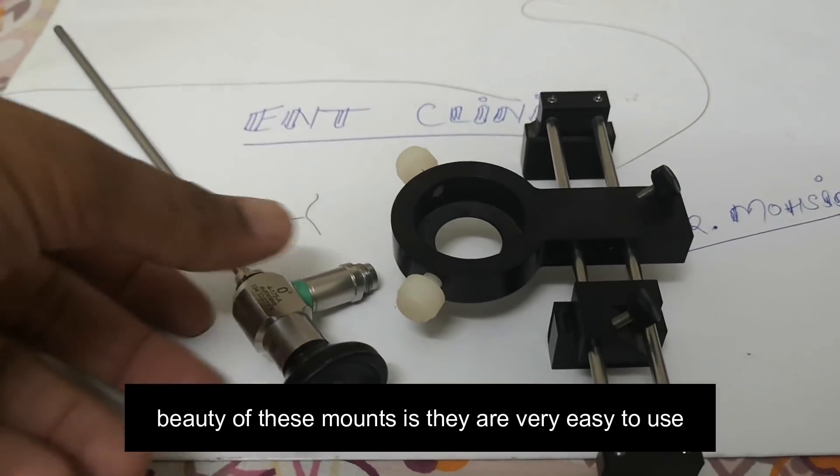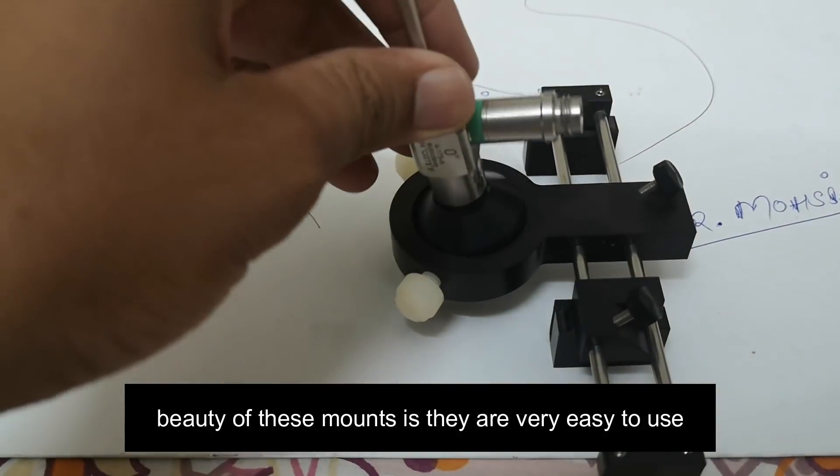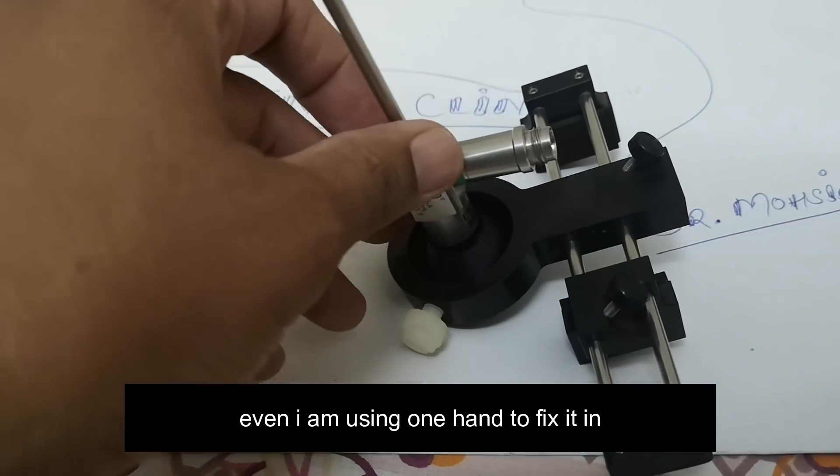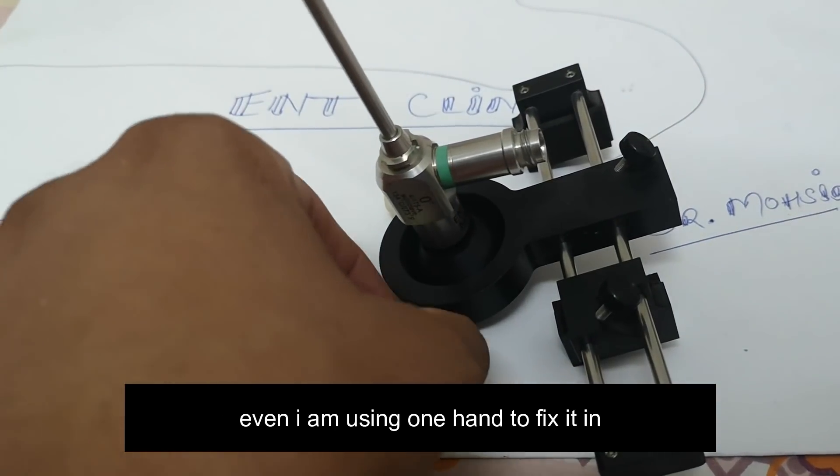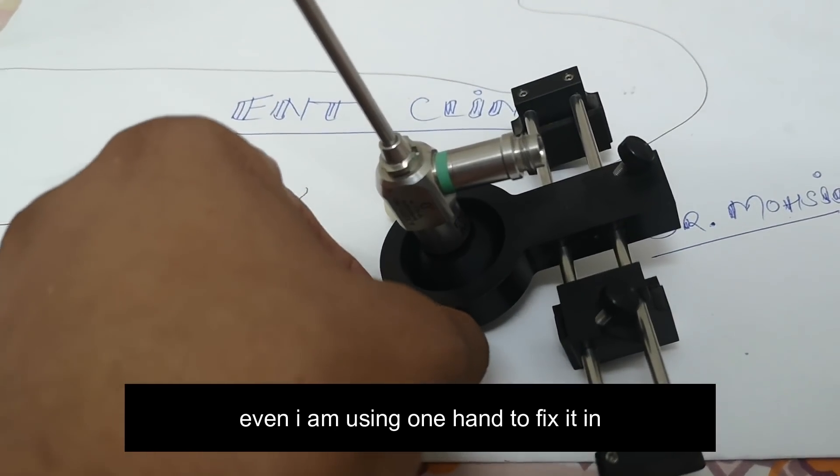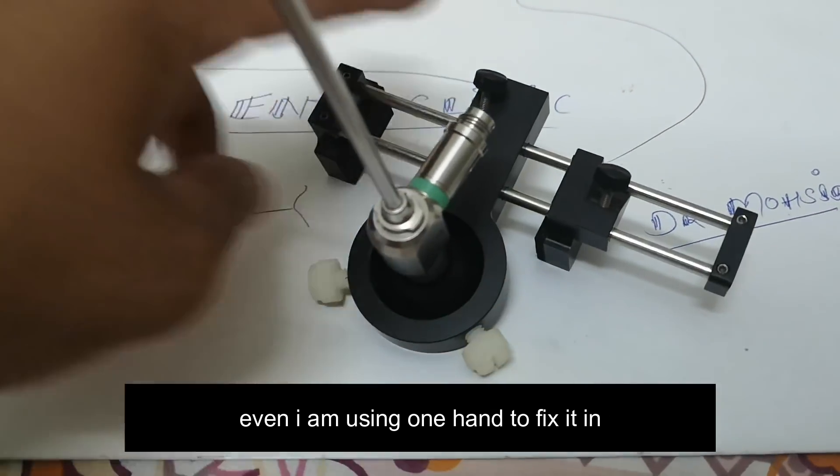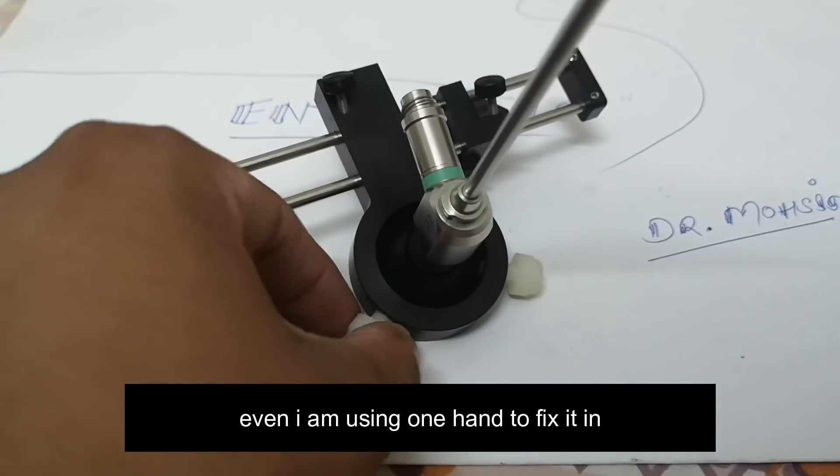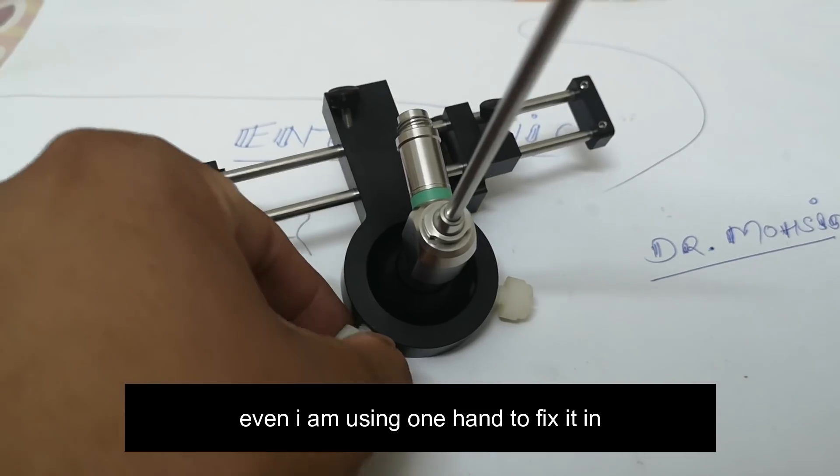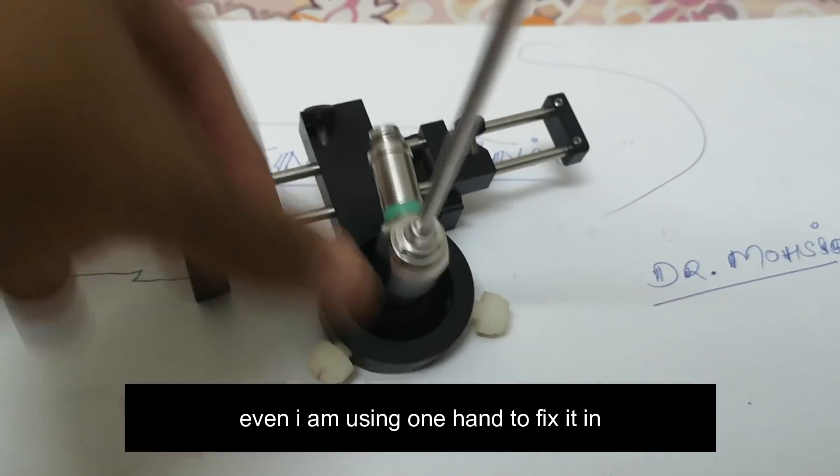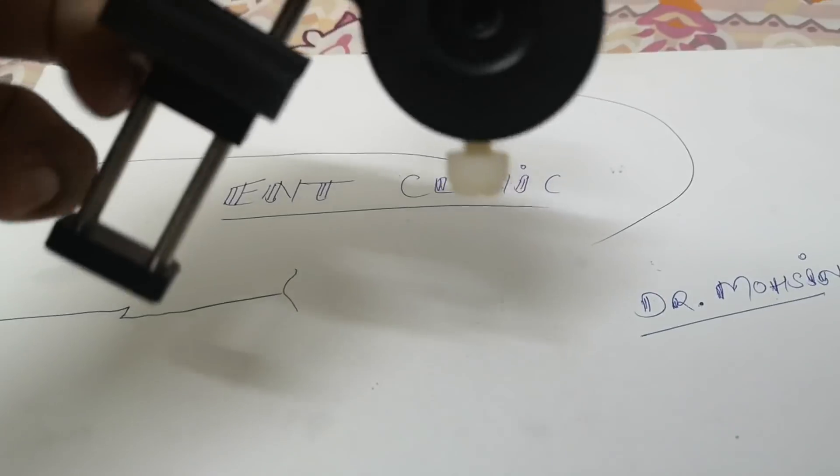The beauty of these mounts is they are very easy to use and the sizes are very good. The endoscope just fits in like this. Even I am just using one hand to fix it in. It goes this way and you can tighten it up. This is the way to put it in the mount.